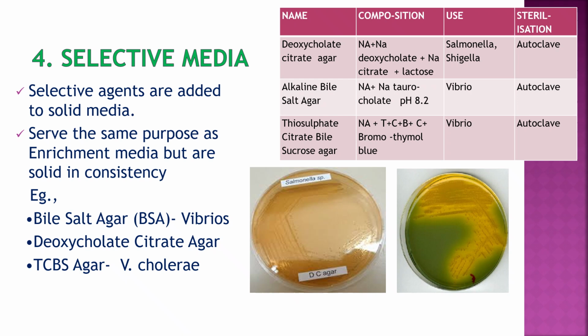For selective solid media, selective agents are added to the solid media, and they act as an enrichment, but they are solid in consistency. So they are bile salt agar, deoxycholate citrate agar, and TCBS for Vibrio.